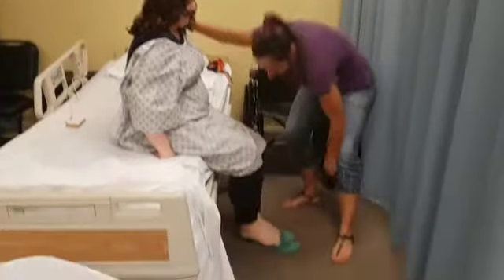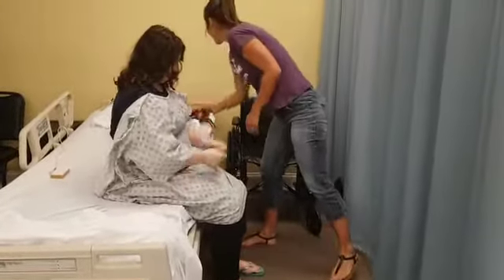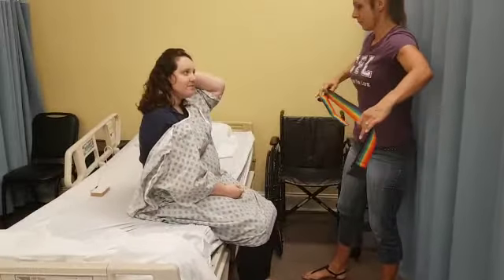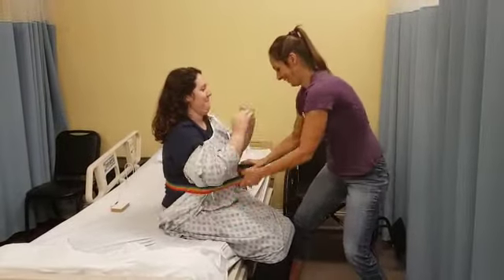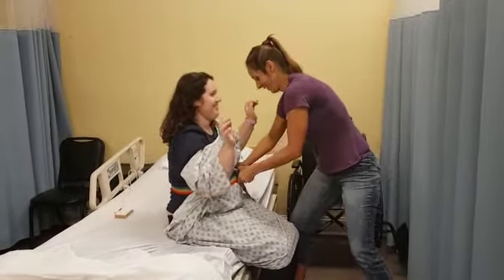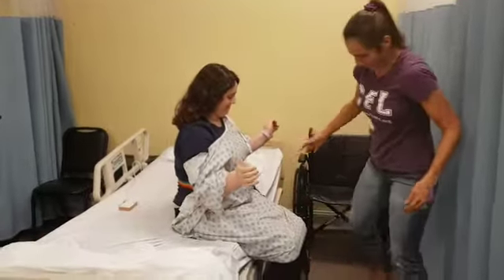Go ahead and put your shoes on. I'll get my gait belt. Don't punch me in the face. All right, I want to make sure her feet are flat on the floor.